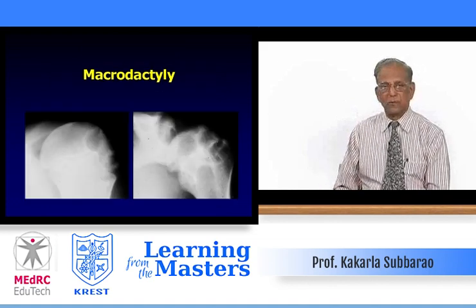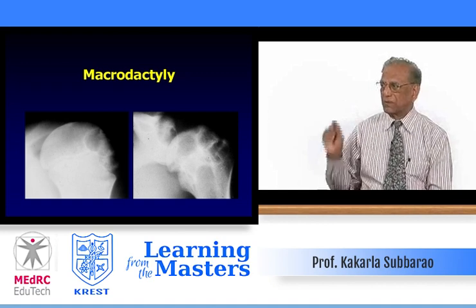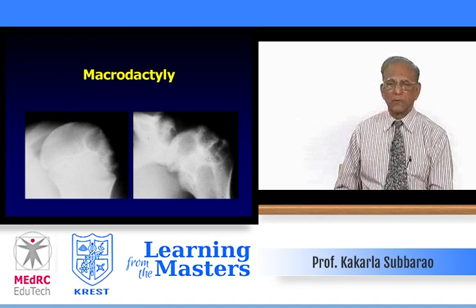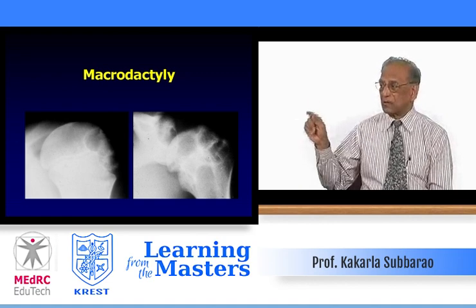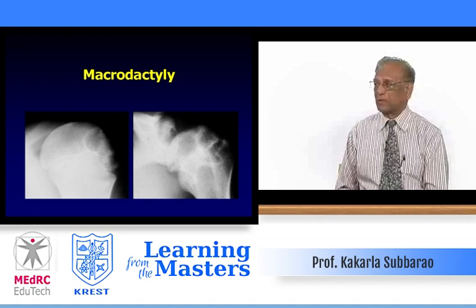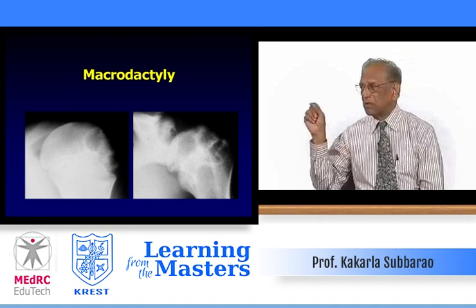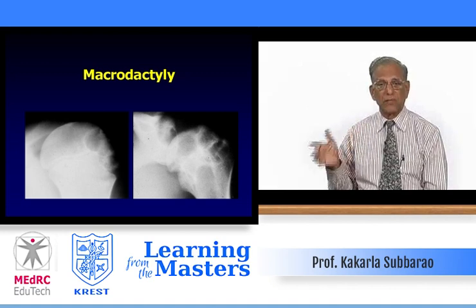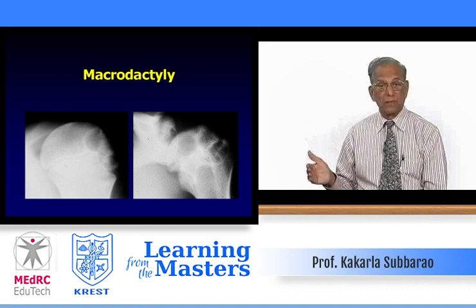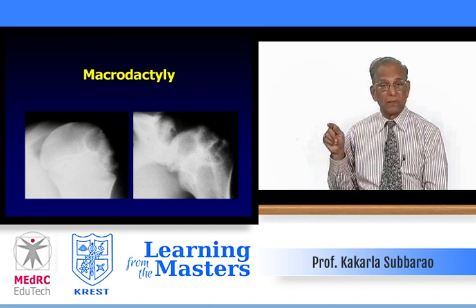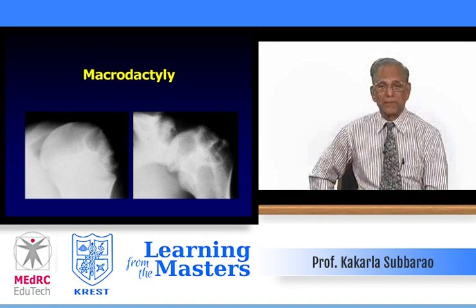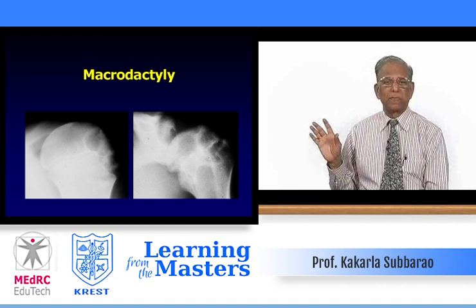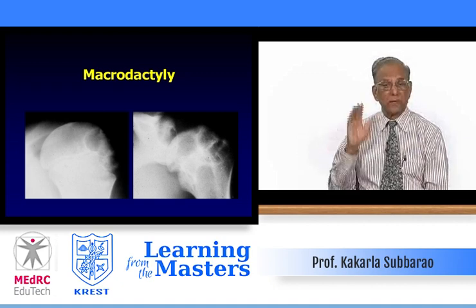Two humeri — on the left side, the epiphyses are just closing; the patient is about 17 years old with a painful shoulder. There is a lytic lesion in the epiphysis and also extending into part of the metaphysis. If you look carefully, there may be some calcifications. This is chondroblastoma — an epiphyseal lesion that sometimes extends to the metaphysis. If there is calcification, it is definitely chondroblastoma; in the absence of calcification, you cannot rule it out.